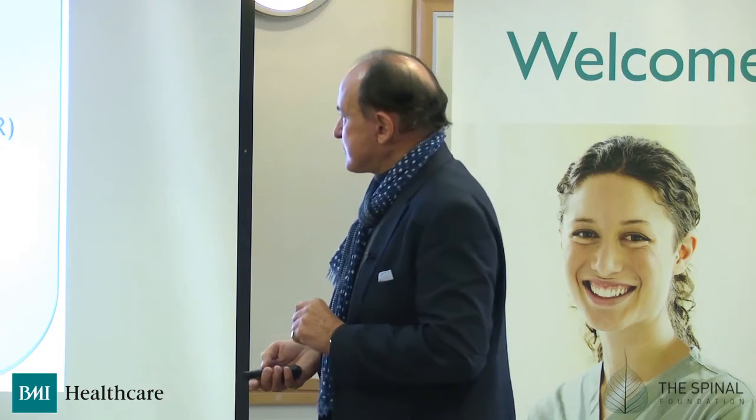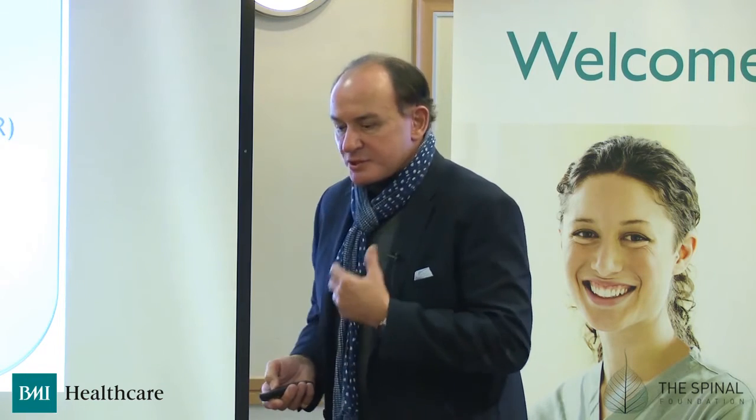Of course, in some cases, the most difficult of these are those where there's a cage that's slightly misplaced, or a total disc replacement or caging, intervertebral caging that's been done through the anterior approach, where disc material has been left behind the cage and is therefore protruding. So you have to be very careful how you chamfer off that protrusion without exposing the disc replacement or cage. Then again, high intensity zones we can treat by going into the disc and lasering.